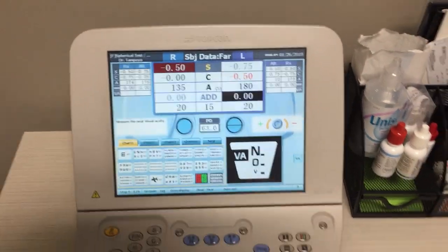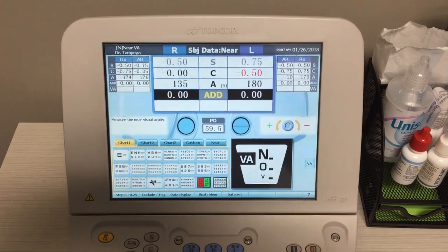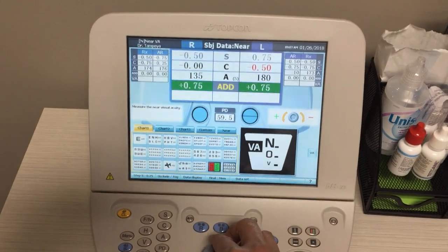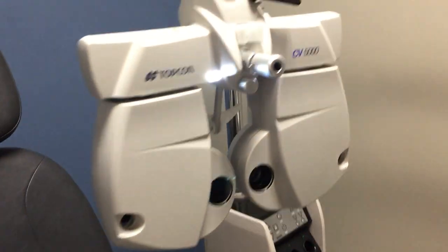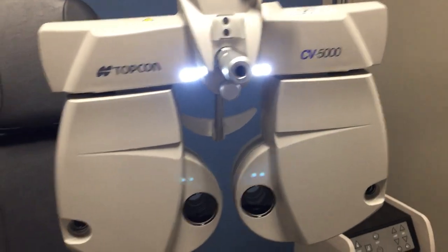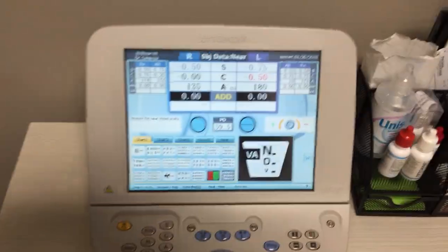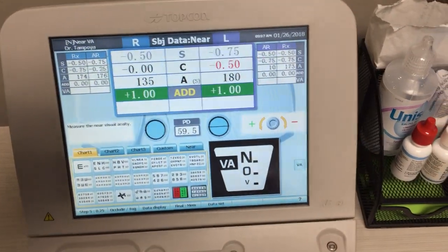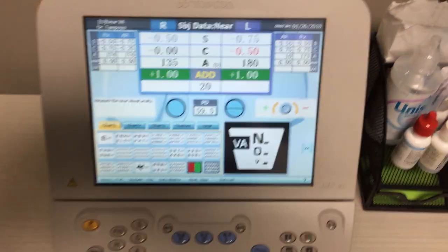Now we're testing near — up close. The ADD portion is highlighted, meaning we can add power or not. If I go over to the autophoropter you'll see these lights are turned on — those lights illuminate the reading card. You would put the reading card on there and test their VAs. I'll say that they have a plus one add and their VA was 2020.